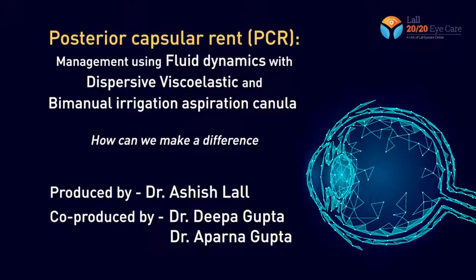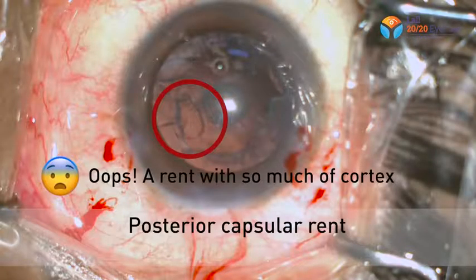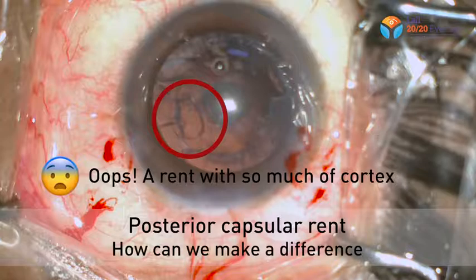In this video, we are going to show a case scenario where we have successfully managed a posterior capsular rent utilizing the fluid dynamics with dispersive viscoelastic and bimanual irrigation aspiration cannula. Friends, so here we are accosted with posterior capsular rent. How can we make a difference?